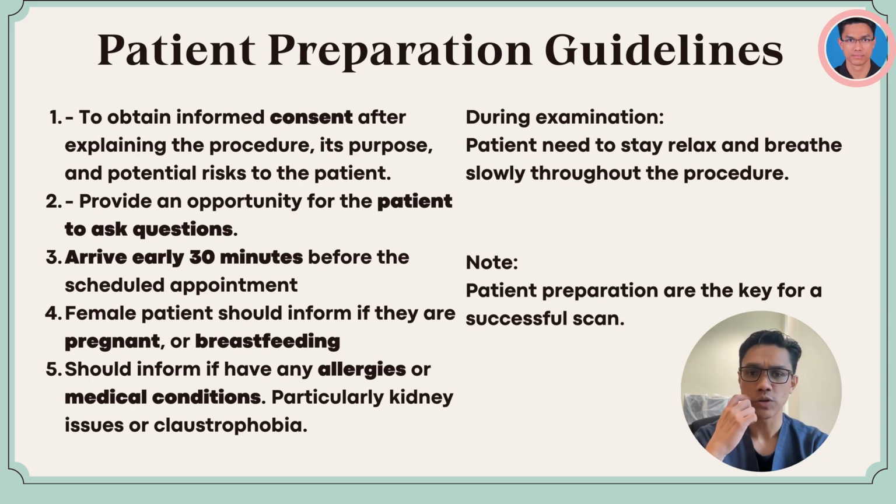Patients should arrive at the facility at least 30 minutes before the scheduled appointment to complete any necessary paperwork and preparations. Female patients should inform the healthcare provider if they are pregnant, planning to become pregnant, or breastfeeding, as special precautions might be needed.